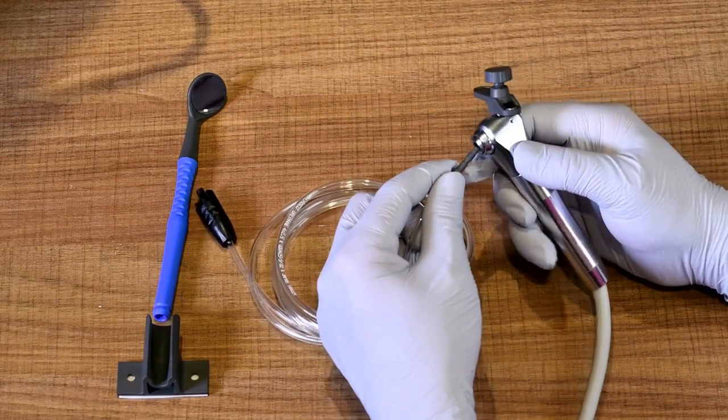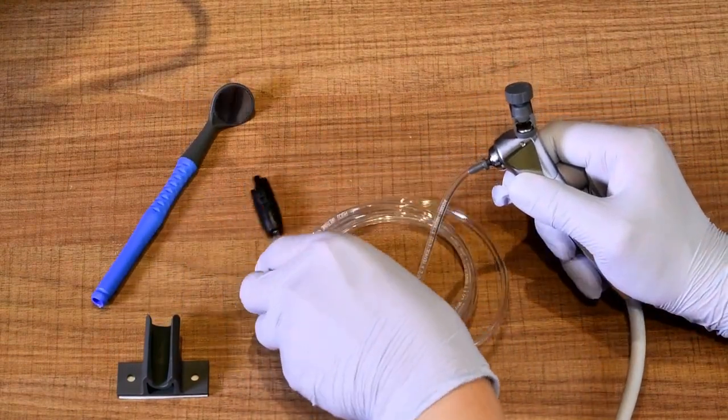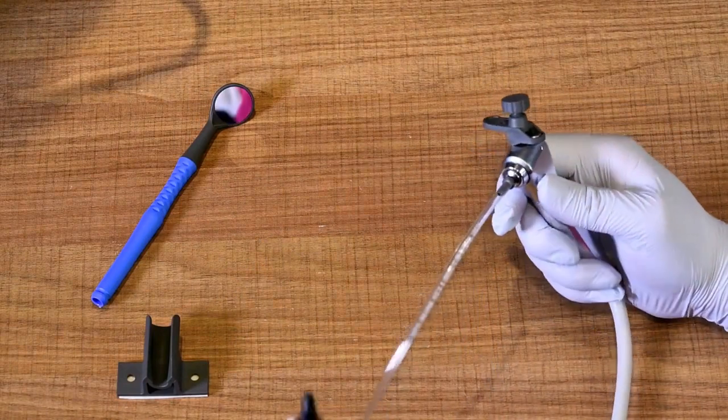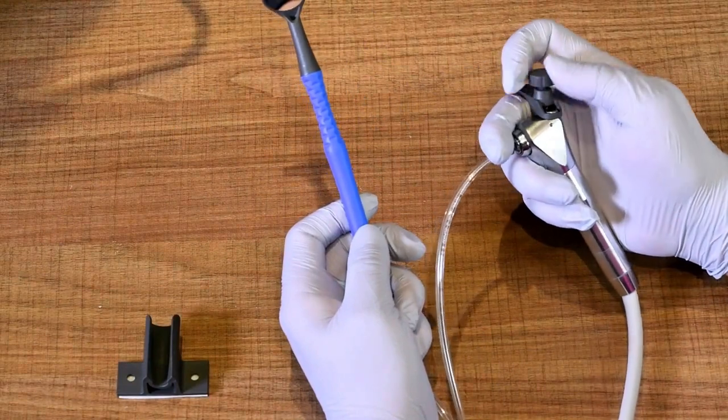Insert one end of the tubing directly into the air water syringe. The other end of the tubing will connect directly to the base of the mirror. Once installed, you can adjust the airflow to your liking.